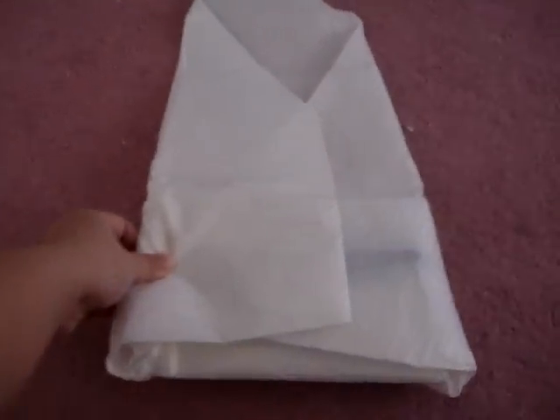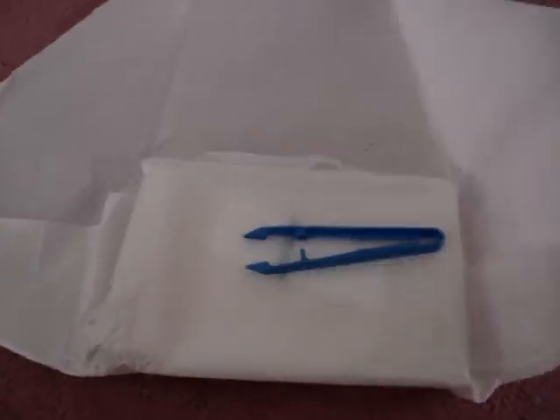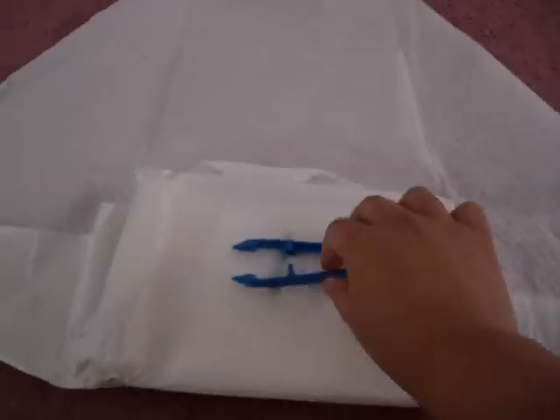I'm going to take this little corner and pull it away from me, and I'm just going to bring it closer. This is the outside so I can touch it. It's still the outside — let me just use my other hand — still the outer surface.